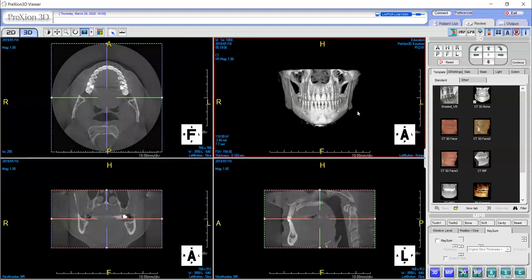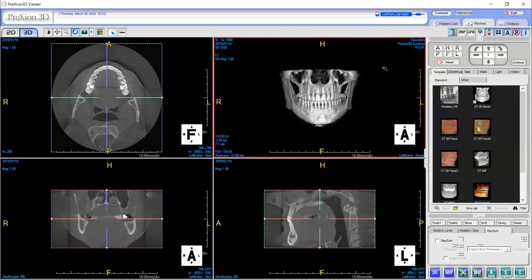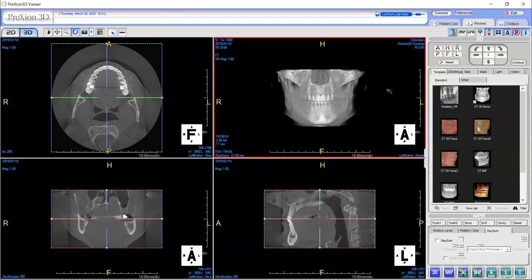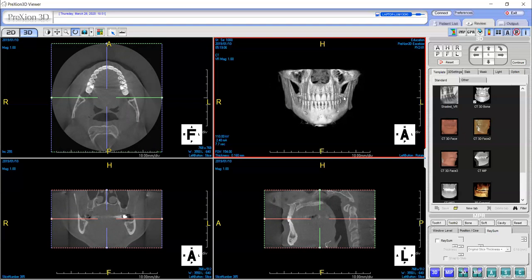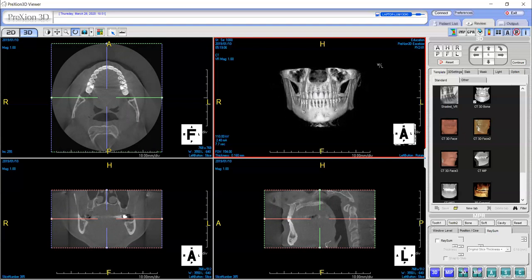If we use that same function on our 3D image — hold down both the right and left click of the mouse and move up and down — you'll notice it goes into a tissue view, and if I move up it goes back to bony. This function can help minimize some of the scatter that you may experience from metal restorations that patients may already have in place. That is the window level function.